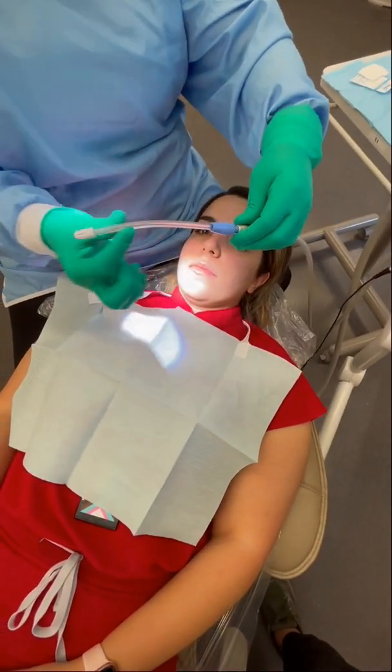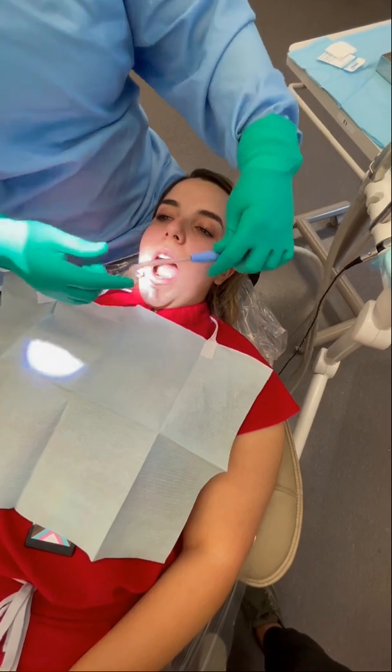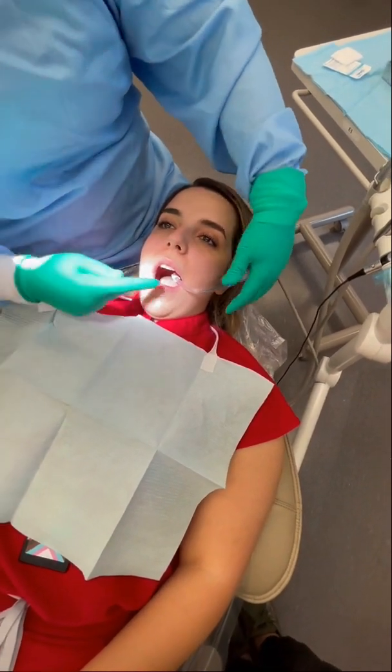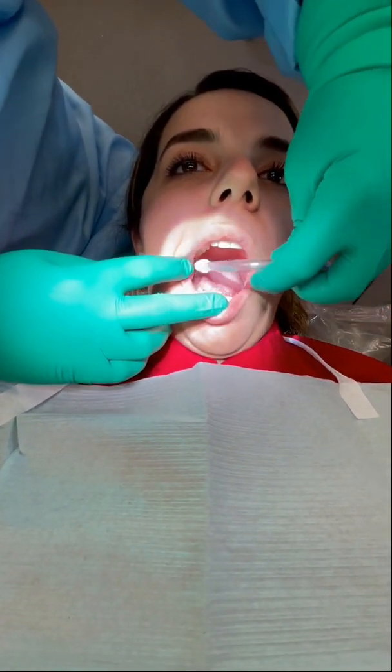A straight tip is never going to work. A folded tip is not really going to hang. If you try and hang this, you can see where that is — that's not getting any water from the corners of the mouth.